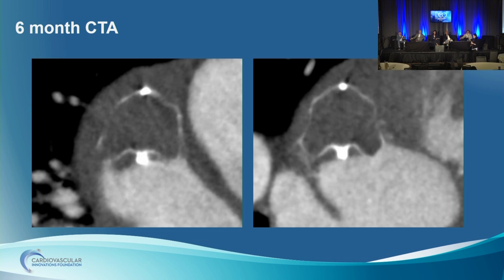I don't know if that's true or just some artifact. I really think we should not make a judgment based on just these two images. I would really think better reformatting of images would let you see the entire surface of the device surrounding, because you don't know whether this is on the device or behind the device. So I would not make a rushed judgment just based on 2D images.